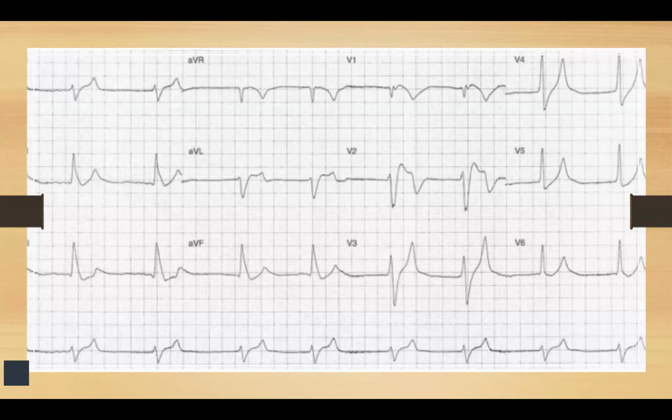So the reason I like this tracing is similar to the ones I showed you as an example. V1 and V2 don't look particularly remarkable. You can see a little bit in lead 1 and then definitely in 6, but most of the peaking is actually in more of the precordial leads, and the inferior leads are not super remarkable. So just giving you another visual representation about the different ways that hyper K can present. All right.